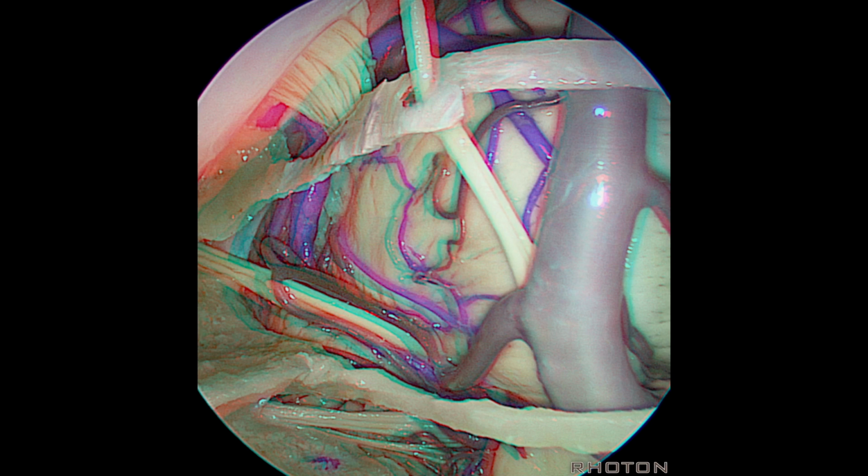You can look above with the angled endoscope and see 5 entering the mid-pons, 7 and 8 proximal to the meatus. Not a bad route if you could do a very focal approach to 7 or 5 right at the brain stem for doing a vascular decompression of these nerves.